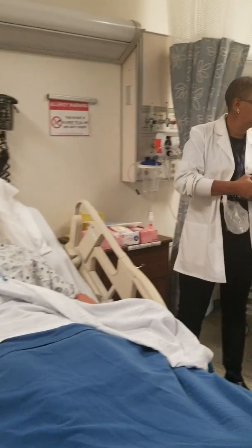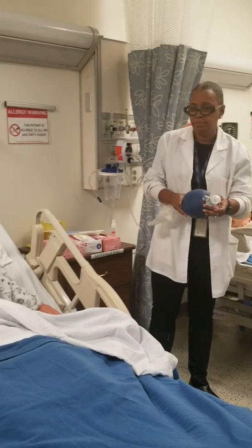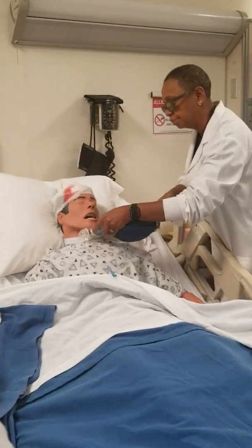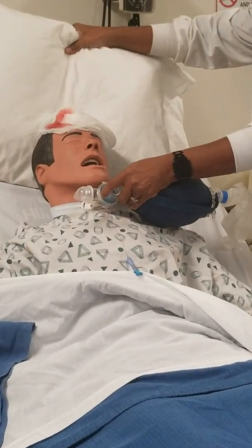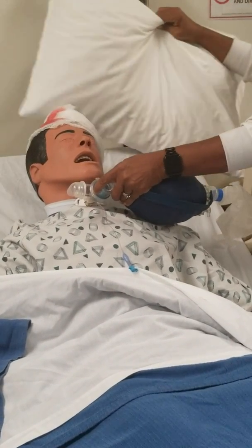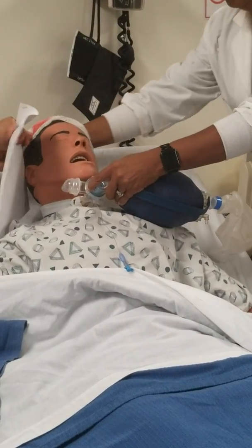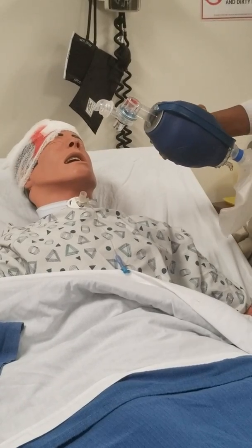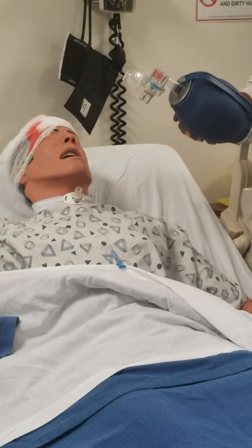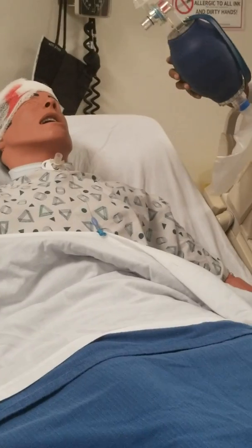He has a trach. If he has his pillow, go ahead and take his pillow from under his head just a little. So you want to get some room up in here. Go ahead and lift your patient up. I'm just showing you how this would go, and then I'm going to show you the whole procedure. Go ahead and bring them up. People, for the most part, don't know to take the mask off. Go ahead and bring them forward.